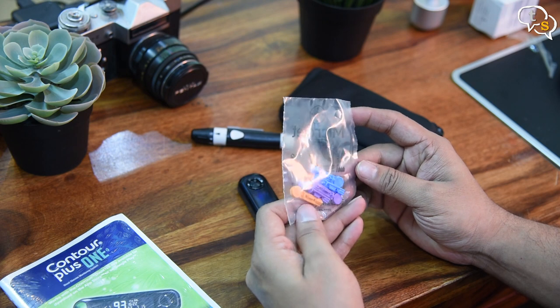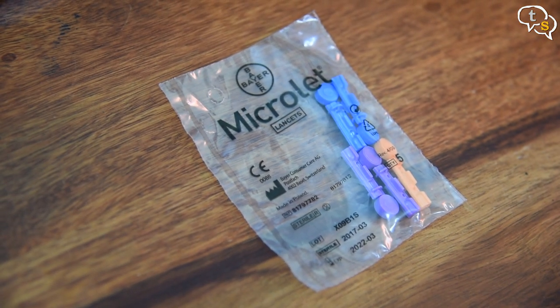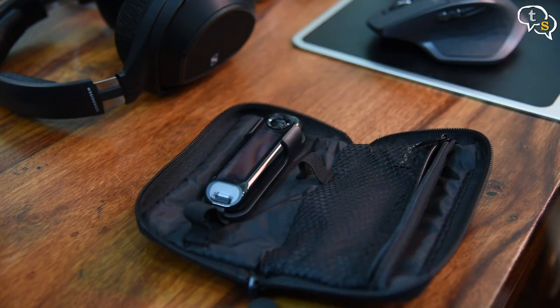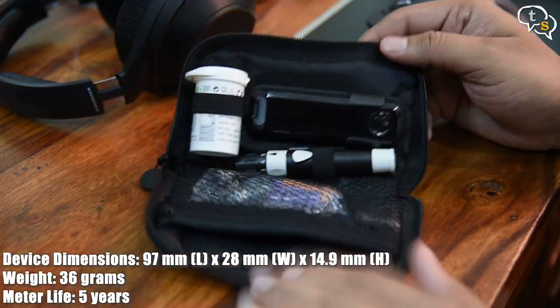The microlet is the actual pin and is to be used by only one person, a maximum of two times, so as to avoid infections. The carrying pouch provided fits everything perfectly, making it easy to carry around for anytime, anywhere testing.